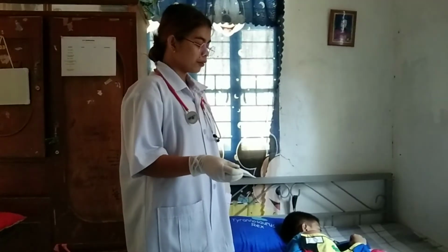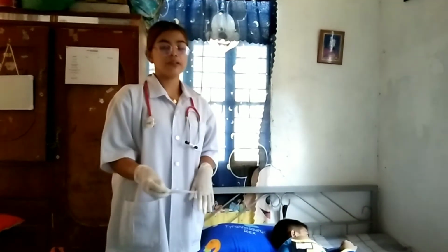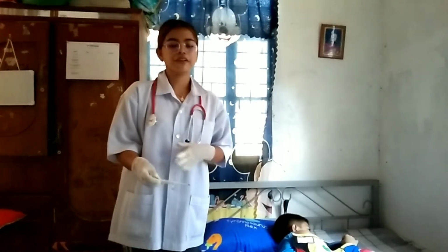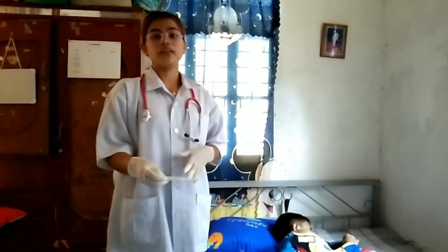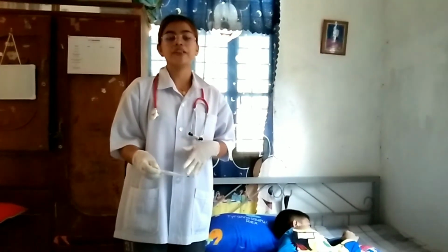After collecting the temperature of the patient in the rectal part, the body temperature of the patient is normal. After collecting the temperature, we need to clean the thermometer or probably dispose of it. After disposing and performing again the hand hygiene or hand washing, we need to document the client's temperature or record it for the client's chart.